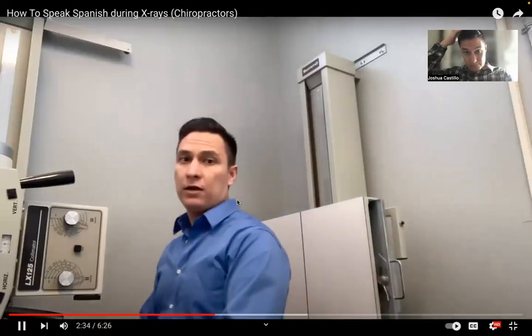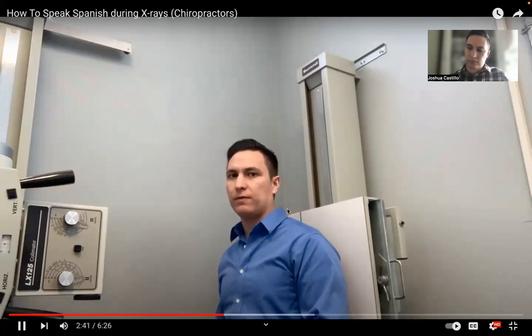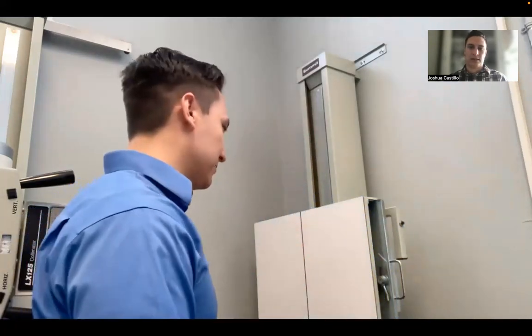Too far forward, you might ask them to go, oh, poquito más atrás. Atrás is backwards. So they may scoot back. And then let's say you want them to go left or right. I mean, that's up to you whether you want to say your right or their right. You have to distinguish. So to be honest, if they're a little bit off to the left, sometimes I might go, hey, puedes mover así, and then I'll scoot a little to the right. And see what I did there. Puedes mover así, así. We're gonna say poquito así, right?